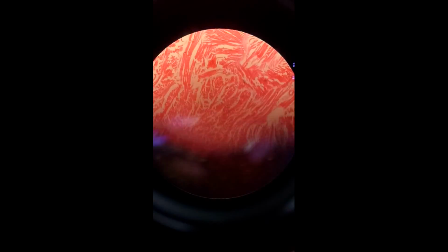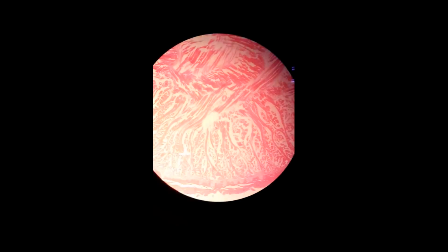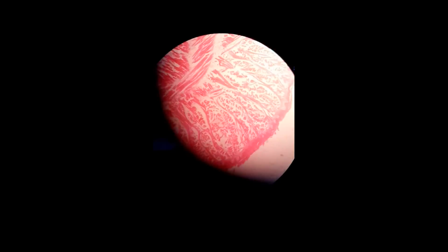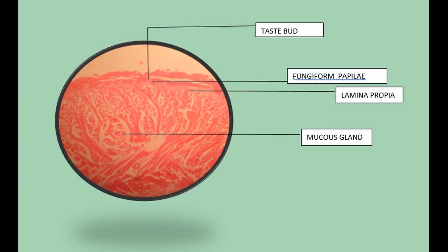Okay, the first slide is the slide of tongue. The tongue is located on the inferior portion of the mouth, just posterior and medial to the teeth. It is a small organ made up of several pairs of muscle covered in a thin, bumpy, skin-like layer. The outside of the tongue contains many rough papillae for gripping food as it is moved by the tongue's muscle.